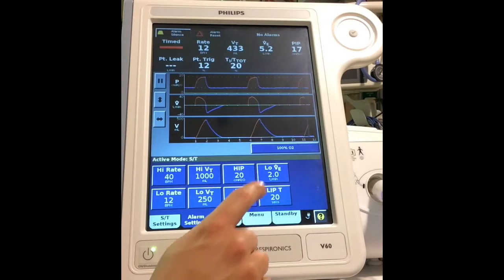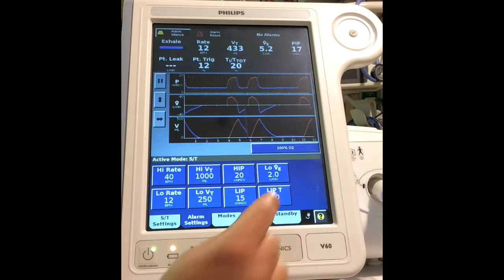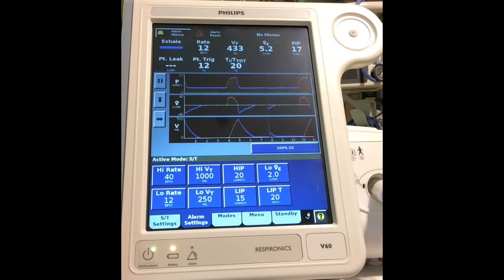Now, our low minute ventilation, we keep that between 2 and 3, and our low inspiratory time is 20 seconds. So if we have a leak somewhere or a low inspiratory pressure, it allows it 20 seconds to correct itself. If it does not happen within 20 seconds, we get an alarm.